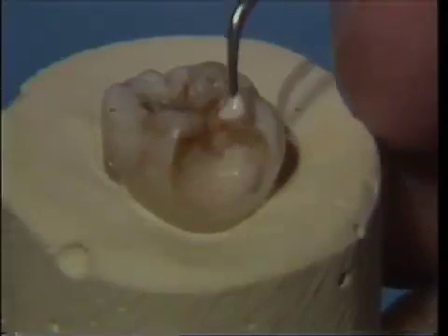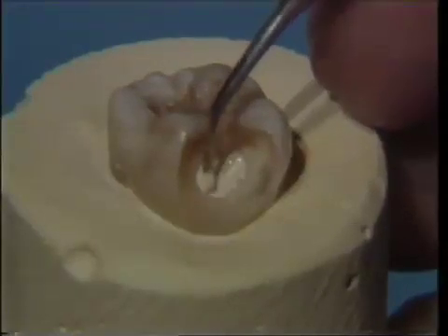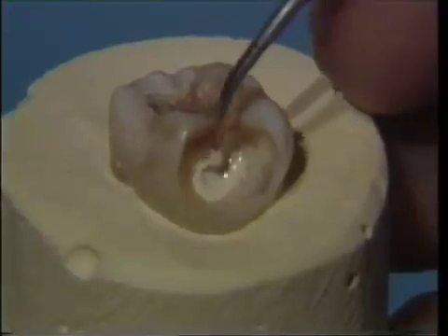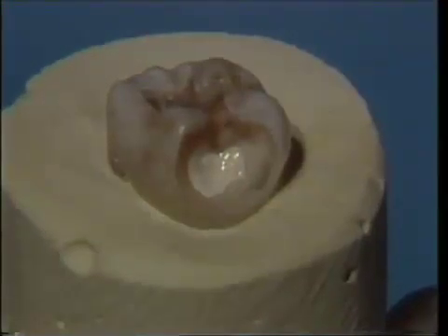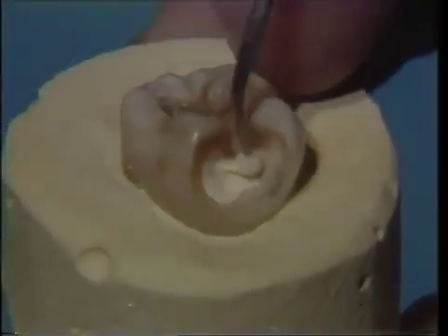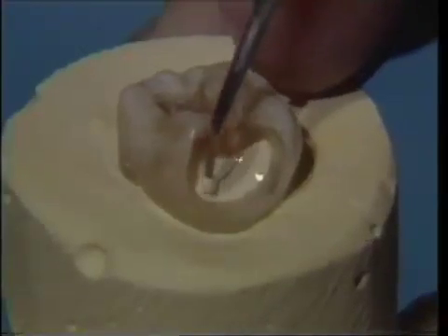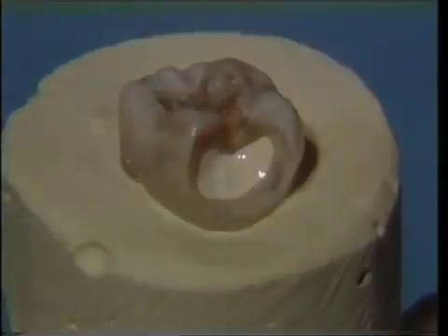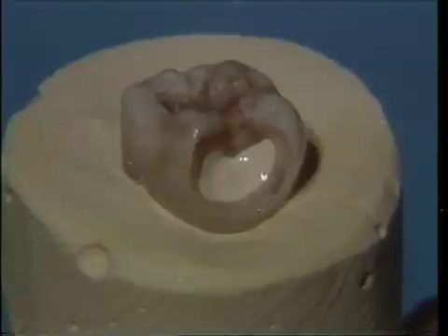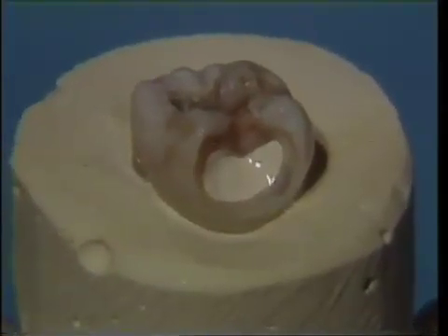We'll now bring one little drop of the material in and place it directly on the axial wall, and begin to move that material out towards the periphery making sure that our margins stay clean of the base material. A second increment might be in order to be sure that we have covered all the areas and have an even thickness of the paste around the periphery of the dentinal area. This material is going to be used for pulpal protection because it is impermeable in nature and will sufficiently resist the conductivity of hot and cold through to the nerve, and it also will provide stimulation for secondary dentin formation.